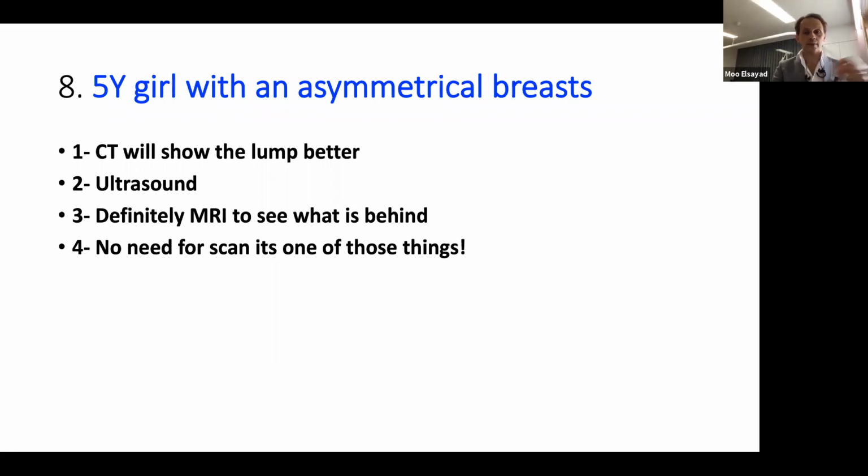And I know when you say a breast, it needs to be scanned by the breast ultrasound team. But I think this is something that a pediatric radiologist who doesn't do breast imaging can scan. And we do this all the time. I do some of my practice in pediatrics and I scan them in and out. I understand your anxiety because in the private sector, they have the same rules. Breast, no one can do it except the breast team. But this actually is not a breast, it's pediatric. So it's a chest wall. So what we said here, if you refer as asymmetrical chest wall, and then we know it's a breast, we scan it and then we give the imaging. But I will find out more from you and maybe update Jyoti on this.